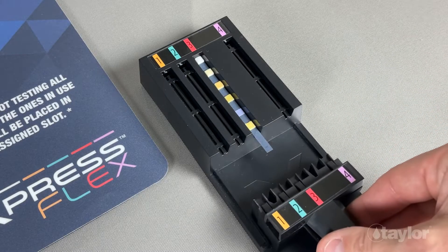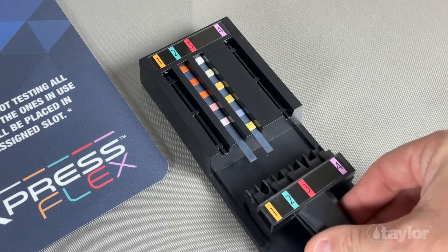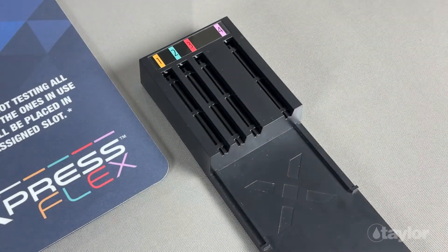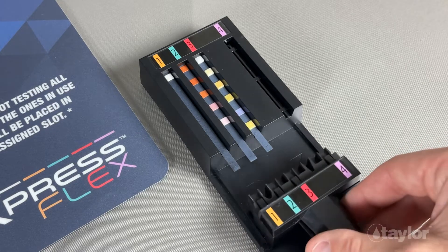ExpressFlex gives you the freedom to use only the strips you need. You can run any combination of strips depending on the results you are targeting. For example, iron may not be commonly found in your area, so the Flex 1 strip would mostly be used to troubleshoot.